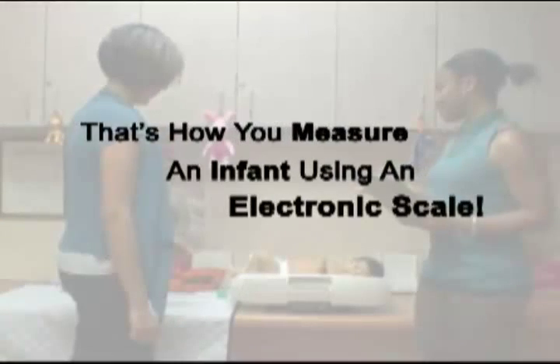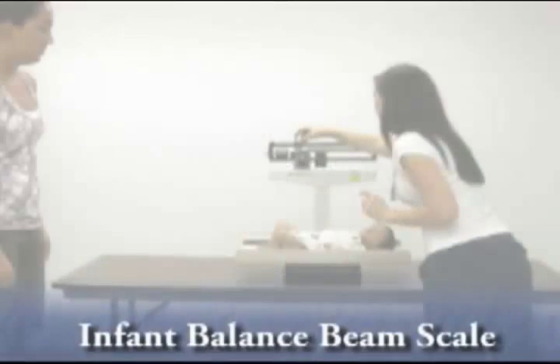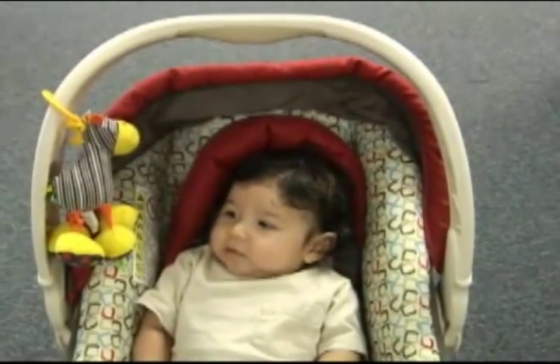That's how you measure the weight of an infant using an electronic scale. In this video, we'll be taking the weight of a two-month-old infant using a balance beam scale.